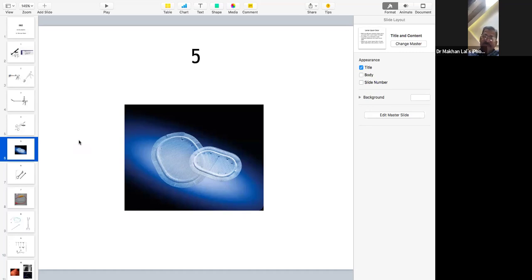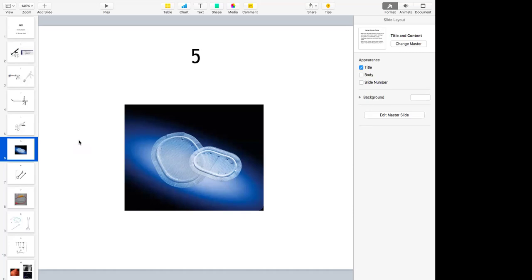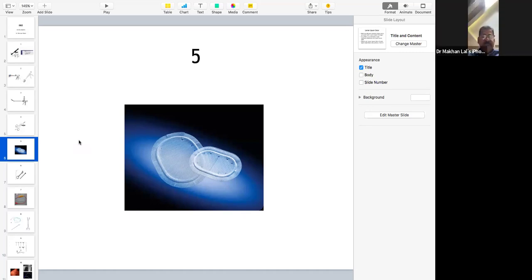We have used it in some cases. These are alternatives to the dual mesh. This titanium coated mesh may be used for intraperitoneal mesh placement. It is claimed that the titanium coating of the polypropylene prevents adhesions. The idea of bilayer mesh was preventing adhesions.